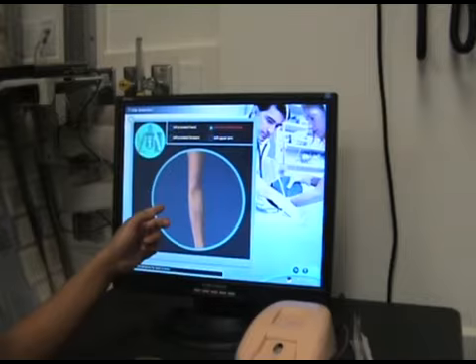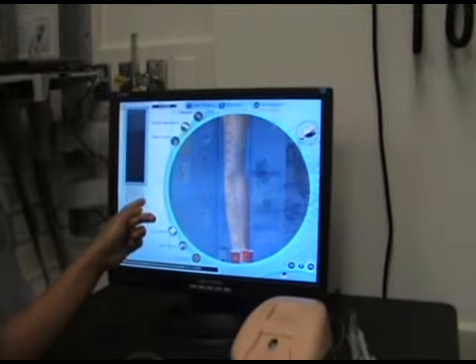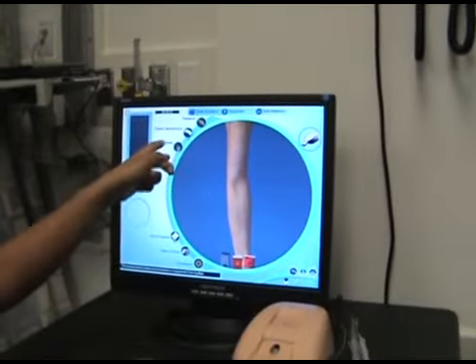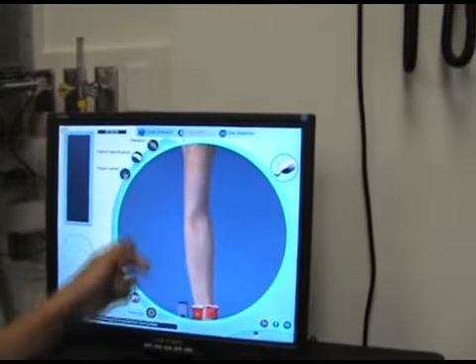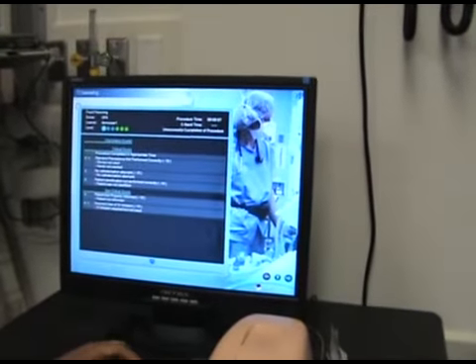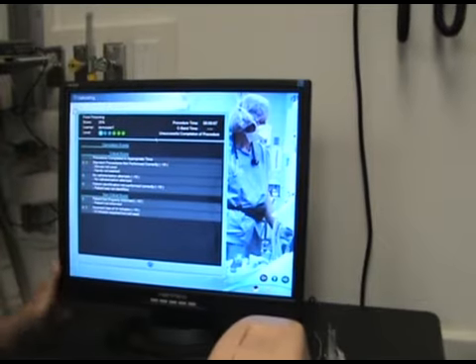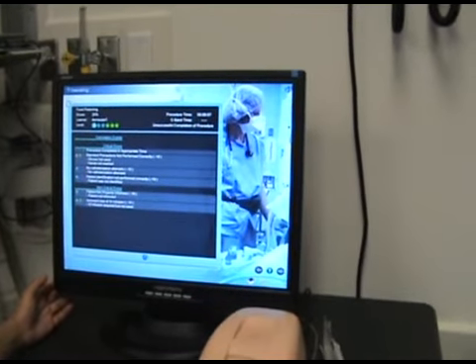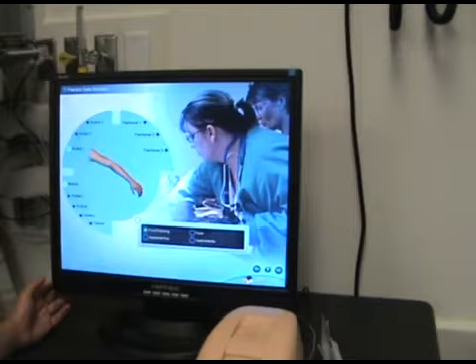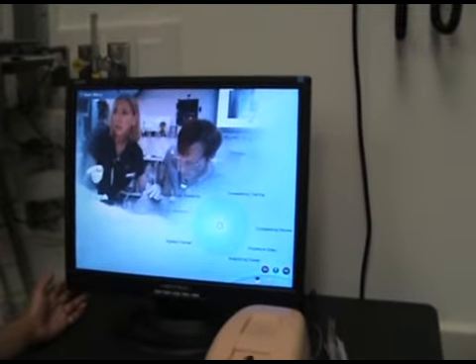I'll choose that. Basically, you choose your items, and then once you choose your items, you click on each step of what you want, and afterwards it gives you a debriefing of how you did. So, alright, let's go back. So that's practice case scenarios.